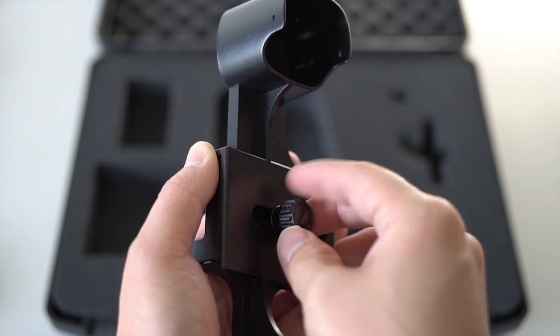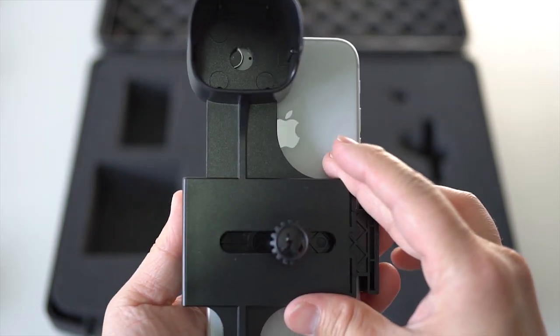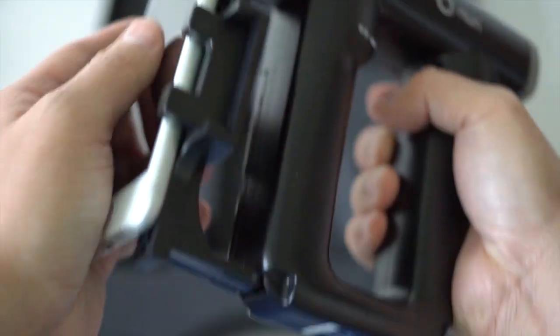Now, place your smartphone onto the adapter. Ensure the phone's camera is well-centered with the lumen. Secure the adapter onto the viewfinder of the ophthalmoscope.